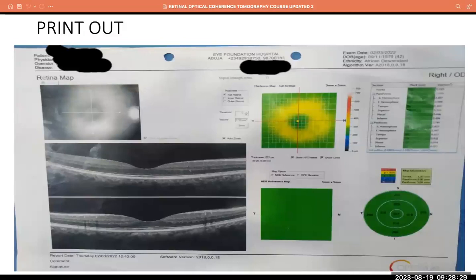So if, for example, you think a patient has a macular hole and you did your Watzke-Allen test and it comes out positive, the line is broken, and you could look at the fundus on the slit lamp and see the break in the macula, and you get an OCT that looks all fine and all good, you should look for where the lines intersected and probably send the patient back to the OCT for another test.